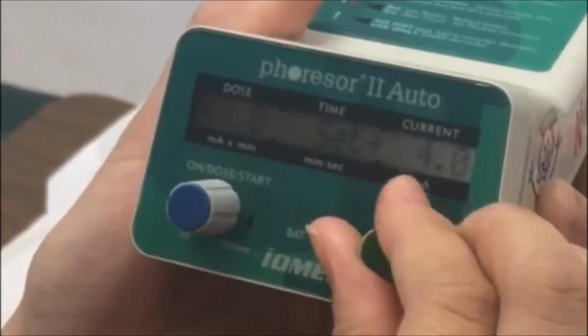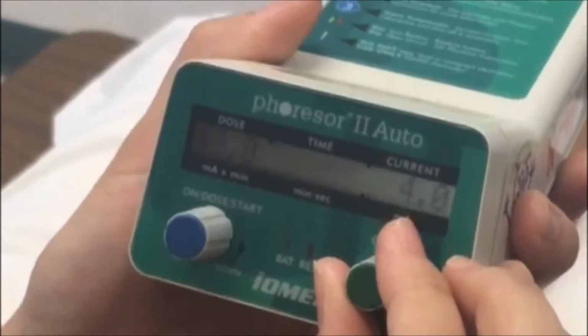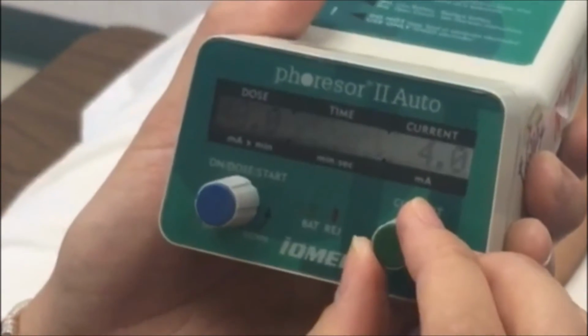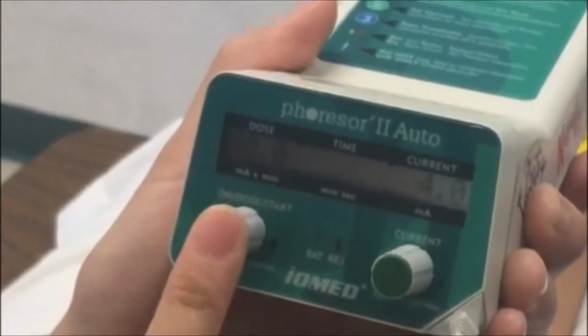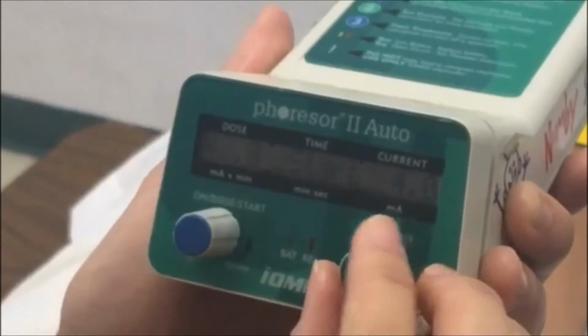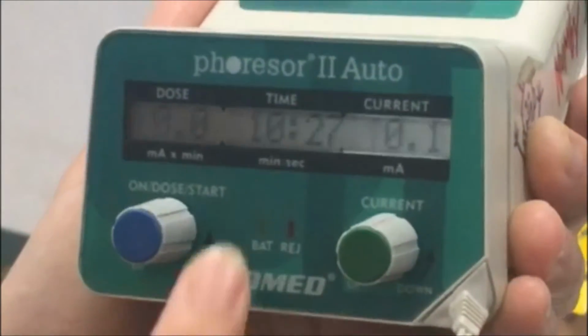If the patient has sensitive skin, then we can change to a 3 current, and then the time is going to be 13.5 minutes. If it's a 2 current, the time is going to be 20 minutes. If it's a 1 current, then the time is going to be 40 minutes. So we always want the lowest time with the highest current. So we start with 4 current and 40 milliamp minutes. Once everything is ready, then we hit the start. Here, it says please wait. The time is on.